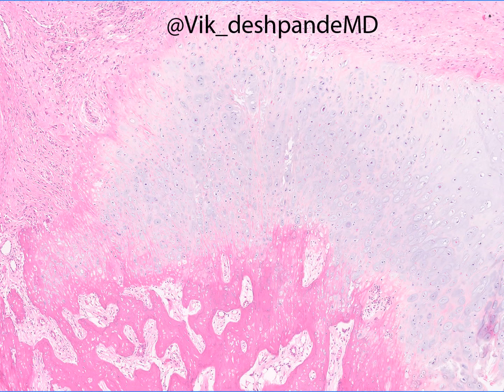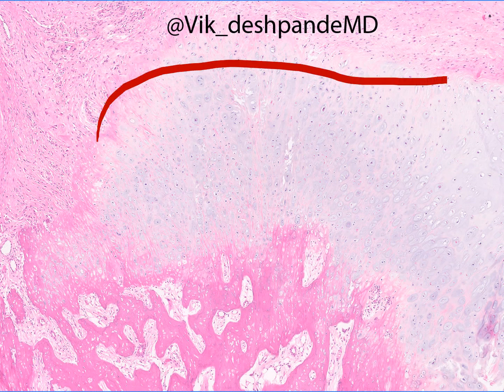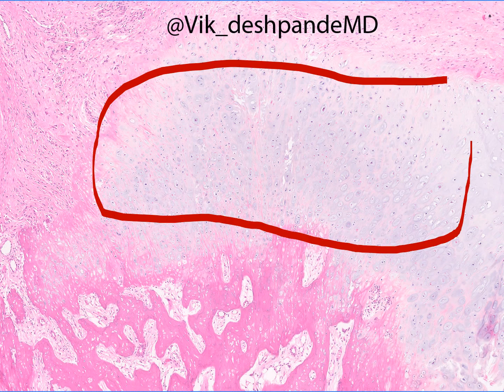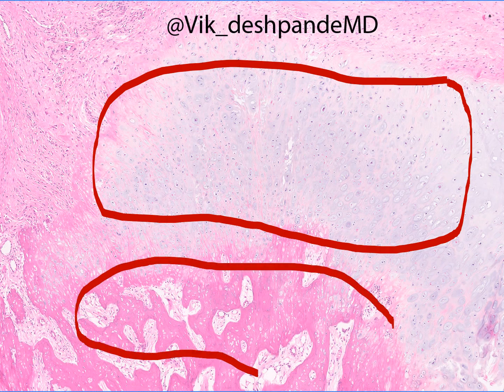Here's a high-power view of that cellular cartilaginous cap. This is indeed quite cellular, and you can see again why you might call this a chondrosarcoma. Beneath that cartilage, as seen on the previous slide, there are thick seams of bone and relatively hypocellular material between those seams.